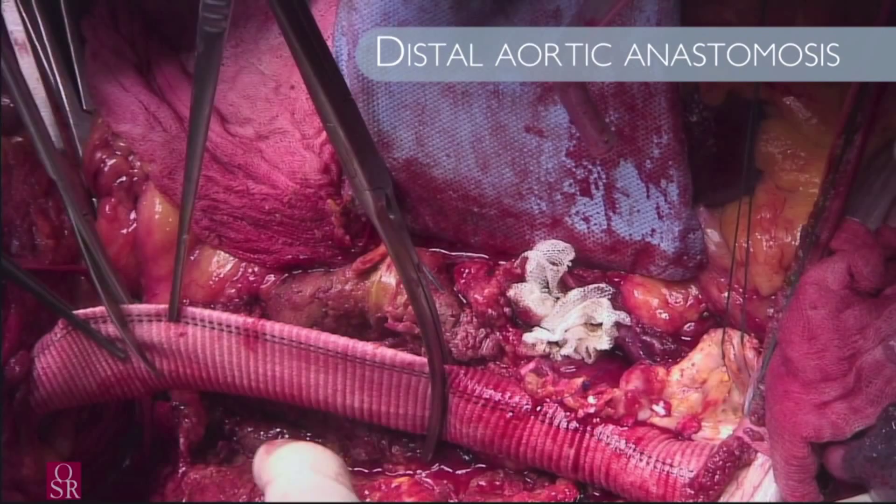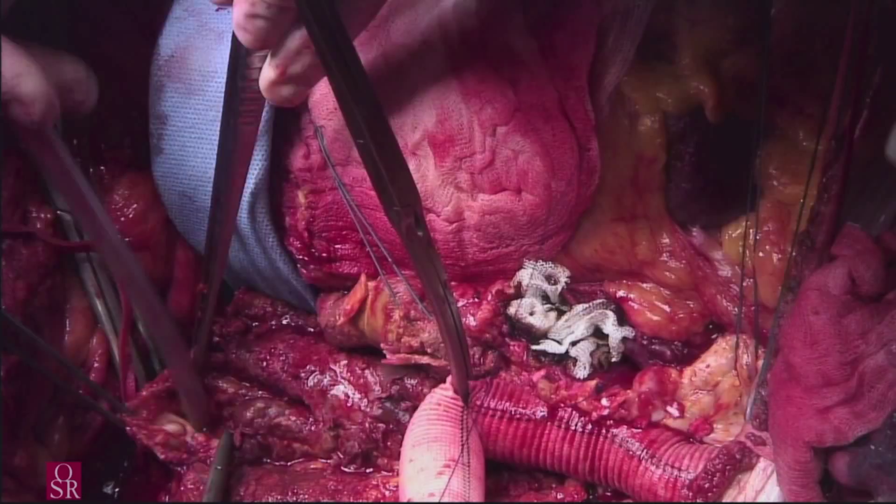Finally, an end-to-end anastomosis with the distal aorta is performed, and the last clamp is removed.